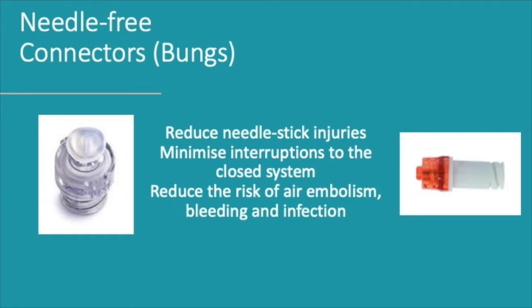Right, needle free. So regardless if it is your PICC line or your cannula, you have needle-free bungs at the end of them. Never use a cannula without the needle-free hub on it. It's a very large hole, and this here is protecting your patient from infections and air embolism. So always make sure that it is firmly on and you are using that correctly. That also goes for your PICC line as well. So this is your bionectar, and that is what a PICC line looks like without it.